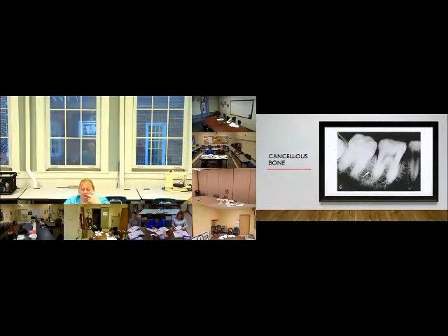And there's some cancellous bone or trabecular bone at the arrow, just to close up that a little bit. So you can't see cortical bone on this slide.